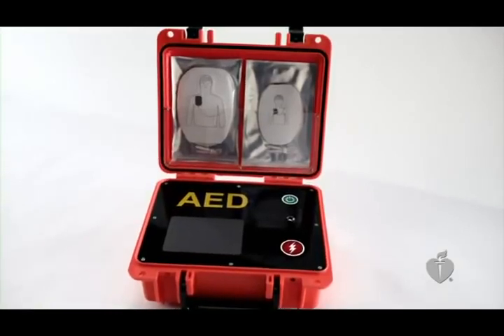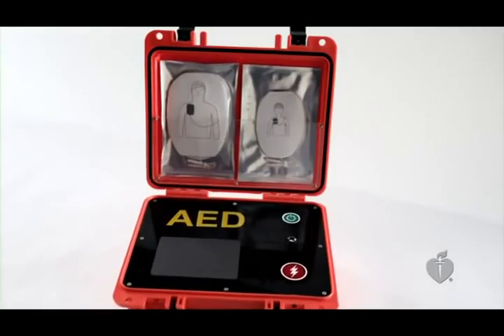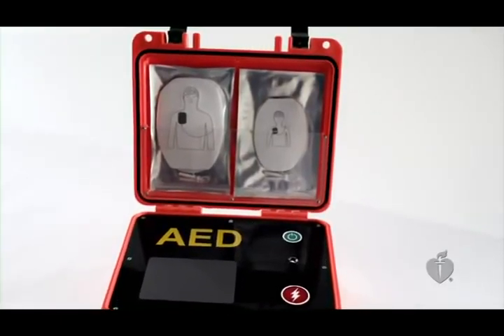If you use a pediatric-capable AED, there are features that allow it to deliver the child-appropriate shock. Which feature is available depends on the type of AED you are using. If your AED includes a smaller size pad designed for children, use it. If not, use the standard pads, making sure they do not touch or overlap.